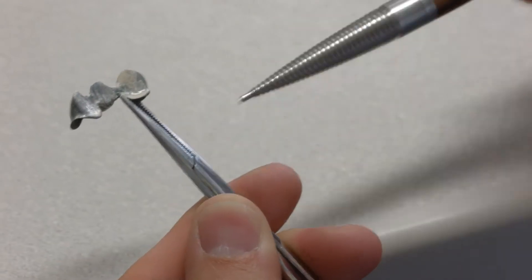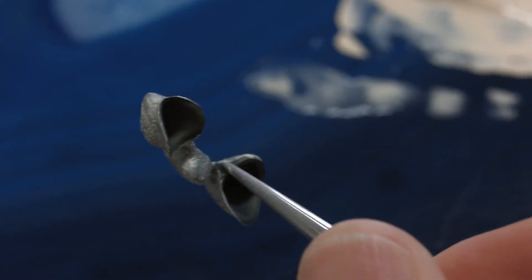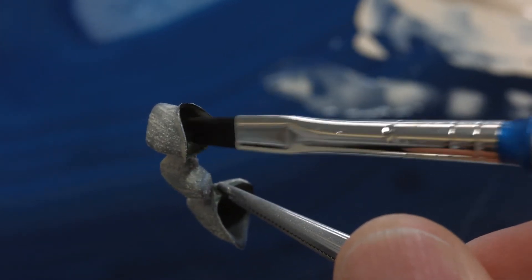It's important to prevent excess opaquer from reaching the inner aspects of the abutment crowns in order to avoid any inaccuracy of fit.